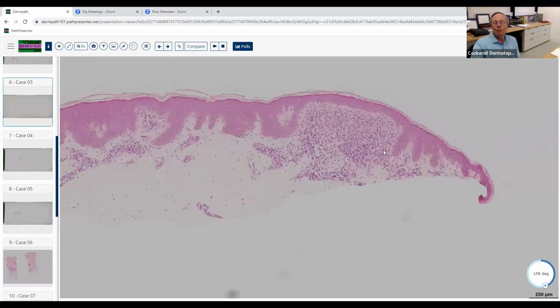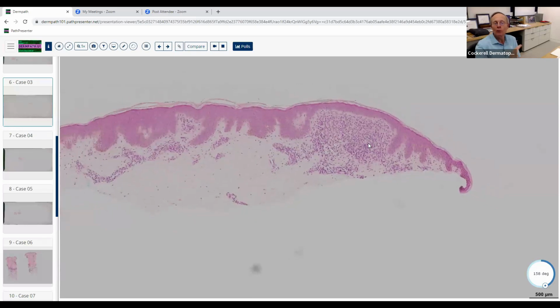So let's say you've gone through this at low magnification, you're looking at your slide on the exam, and then you look down at the multiple choice questions, and they give you 5 choices, and Lichen Nitidus is one of those. But what else might they have there that you need to say it's definitely not this? So what are some other things that they might put in there that might give you a granulomatous inflammation with some sarcoidal morphology, but it wouldn't give you this pattern?